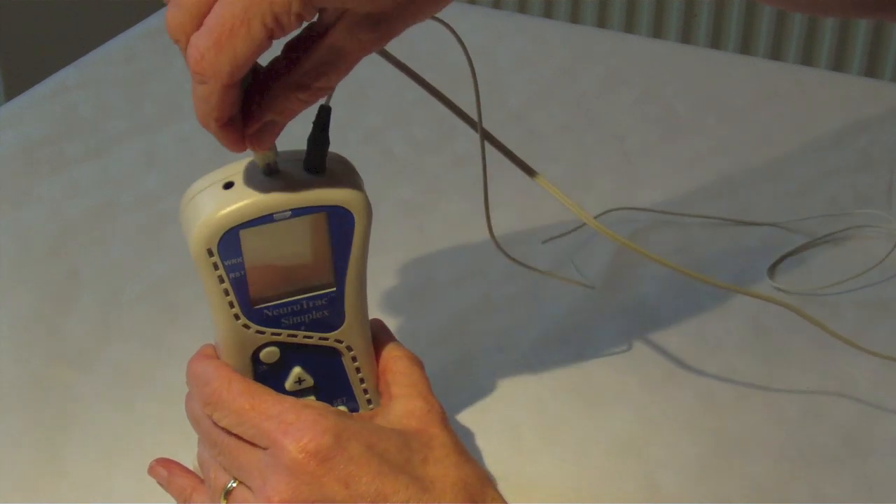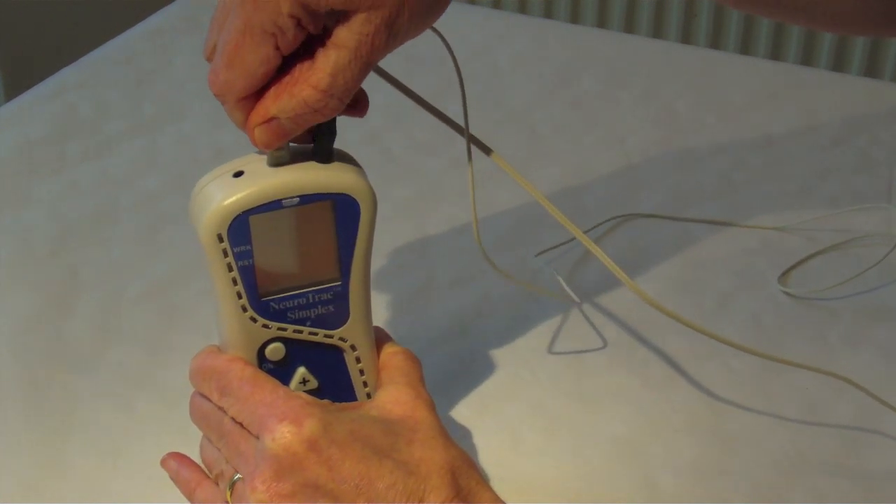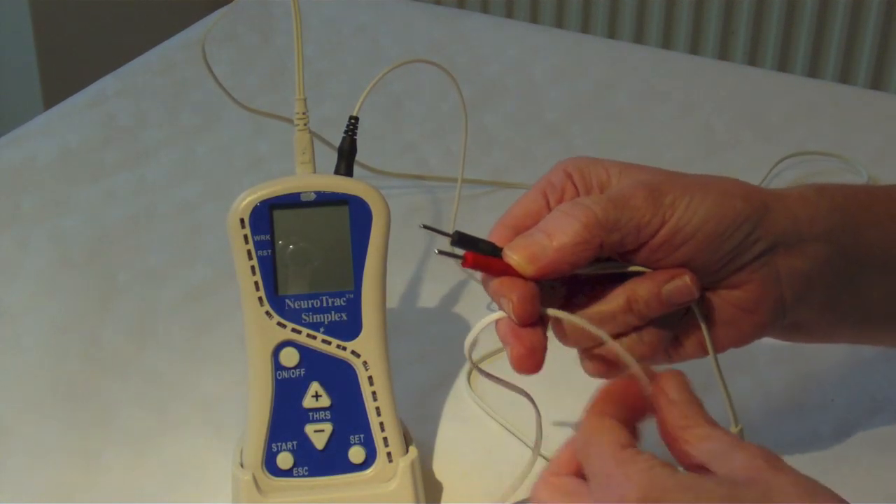Insert the white EMG wire into the middle socket, then connect the periform sensor to the red and black pins at the end of this EMG lead wire.